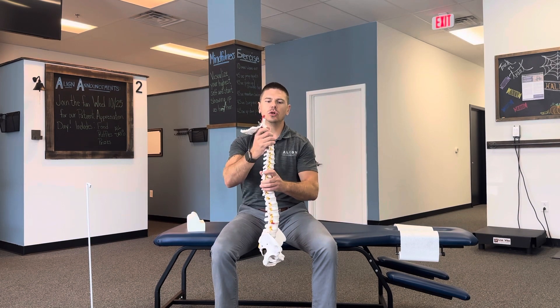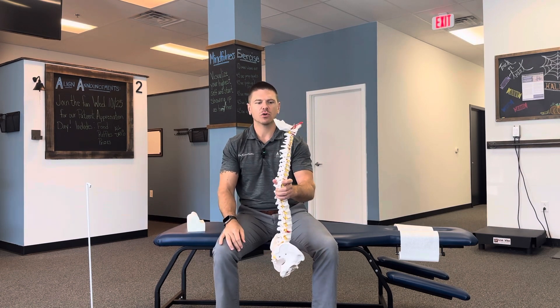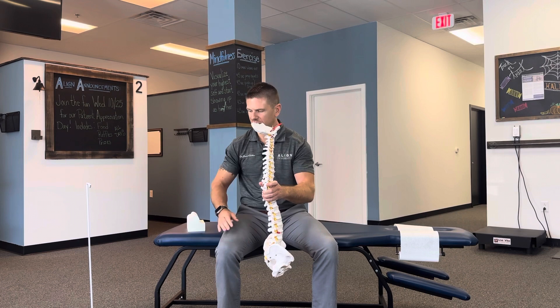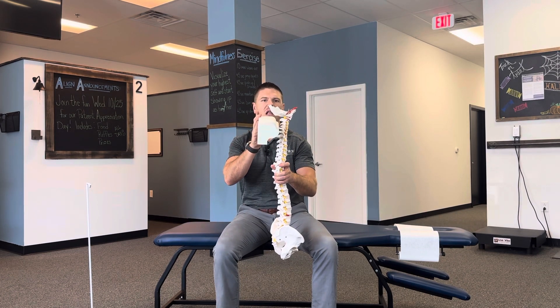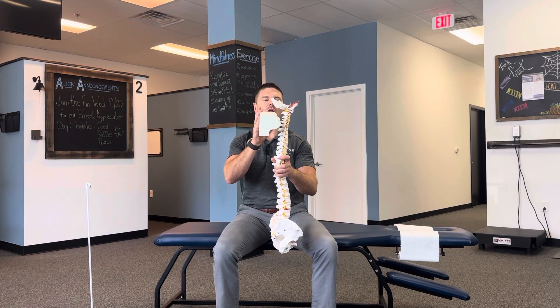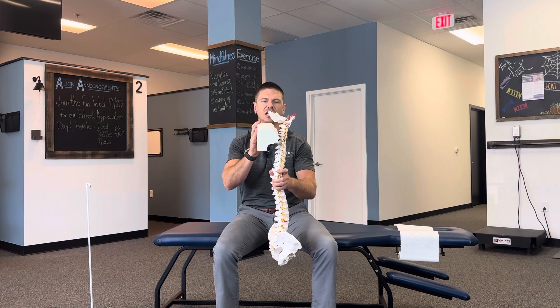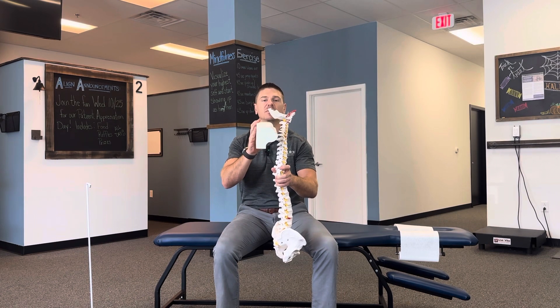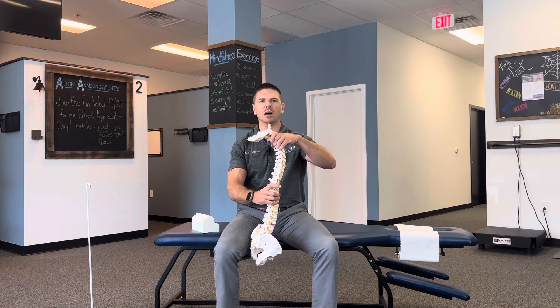If somebody loses that curvature or it's even going in the wrong direction — which unfortunately I see too often these days — what this denner roll is going to do is allow the person to lie on top of it. Over time, that's going to allow the muscles, ligaments, and other connective tissues to adapt and stretch, allowing the spine to conform to a more optimal structure.